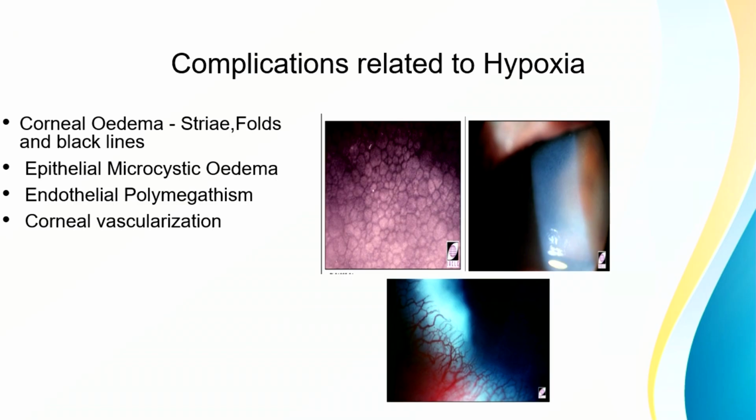The lenses are very comfortable, so they just wear them for 8, 9, 10 hours altogether, where they end up saying that there are halos after I see, or after I remove, or after the 8th hour I have redness. All these things come up. The common management which we do for all these hypoxic cases is discontinuation of the lens until the problem gets solved. For vascularization, maybe we can go one step flatter, like one step loosening the lens so that the lens will move a little.